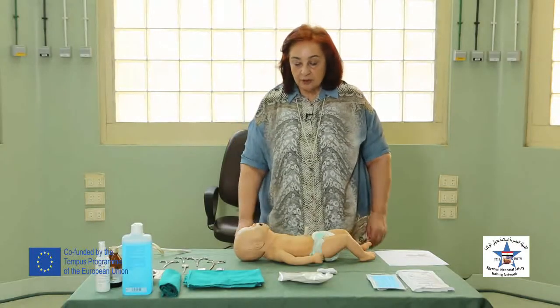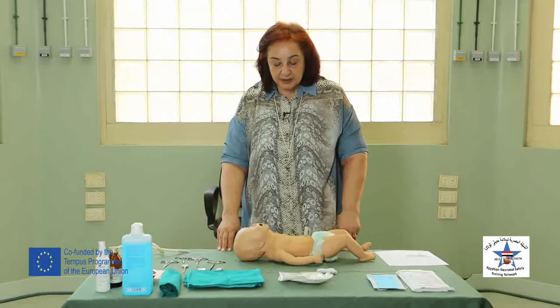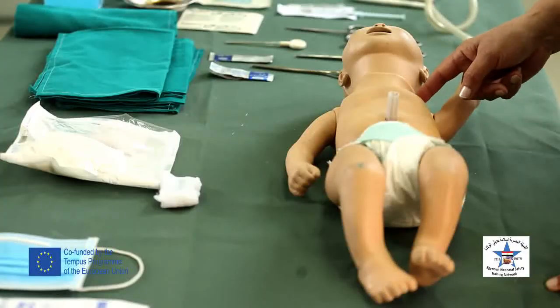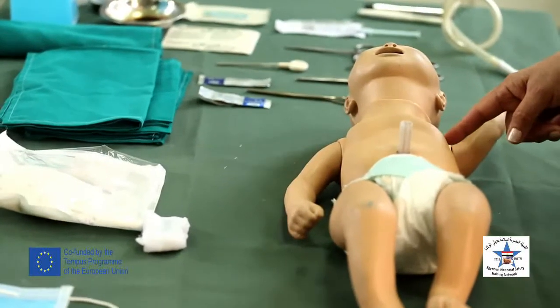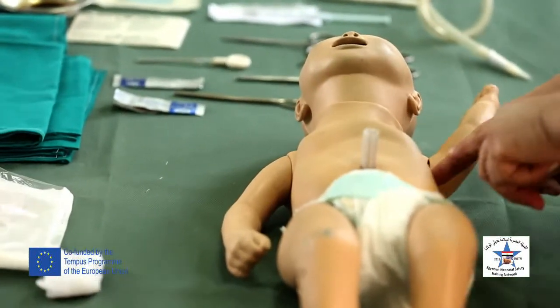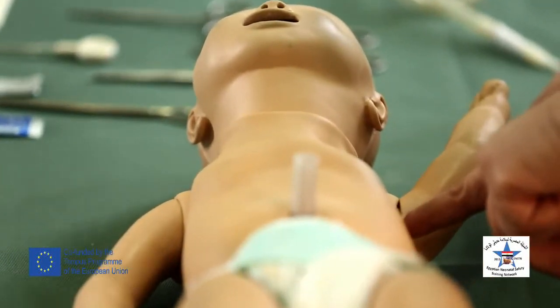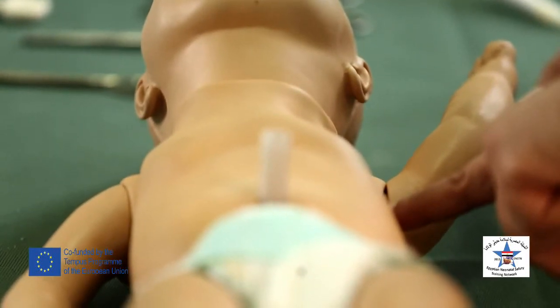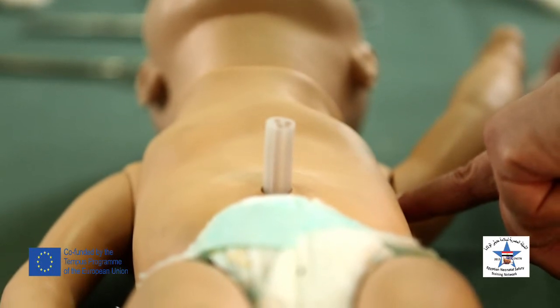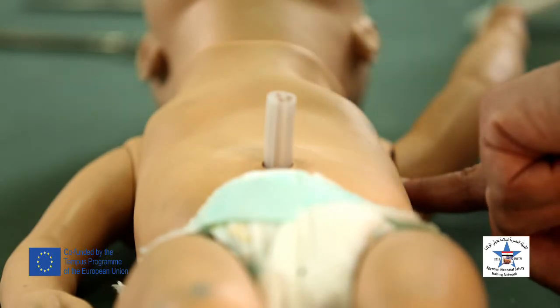I will locate the site of insertion of the chest tube in the 4th or 5th intercostal space in the mid-axillary line. So I will count the 1st, 2nd, 3rd, and 4th intercostal space in the mid-axillary line. Again, I will put my chest tube on the upper border of the 5th rib to avoid putting it on the lower border of the fourth rib where there is a bundle of blood vessels and nerves. Better to mark the site of insertion.